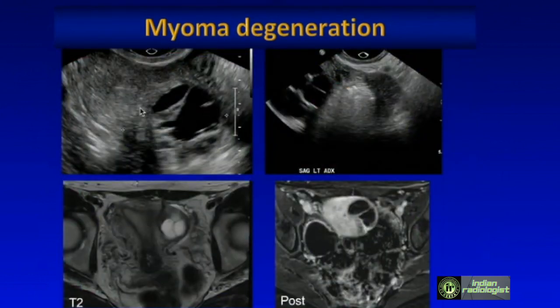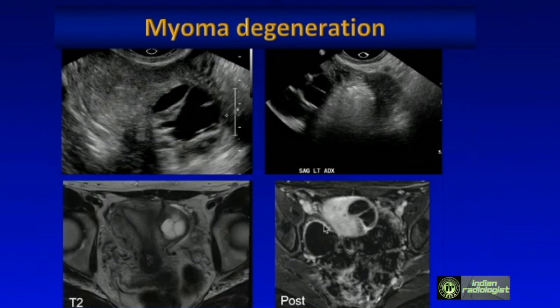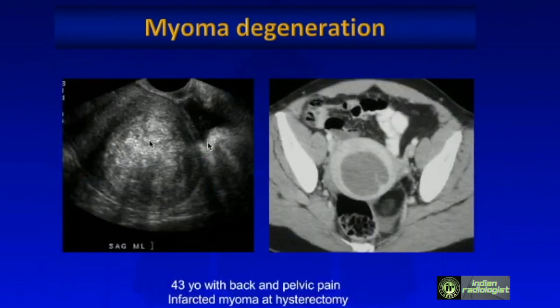Here are examples of cystic degeneration — a cystic lesion in the uterus, which is not a typical appearance for myoma. This patient also had a left ovarian dermoid. On MRI, you can see cystic degeneration with no enhancement in the cystic portion but enhancement in the rest of the fibroid. Having MRI to confirm the diagnosis is really helpful in these cases.